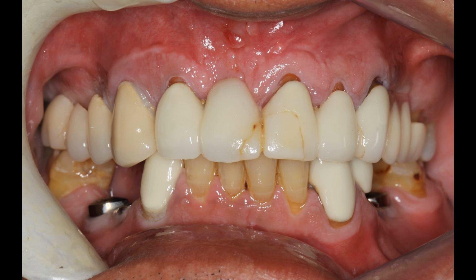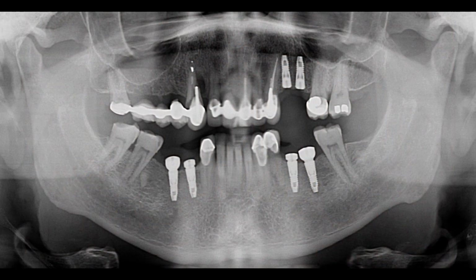high-stress job. He had already had some implants placed, but when he first came in, he had a really badly infected tooth. As you can see here, he had a fractured and infected right canine. So the first thing we did for him was take that tooth out, and I made him a large temporary.